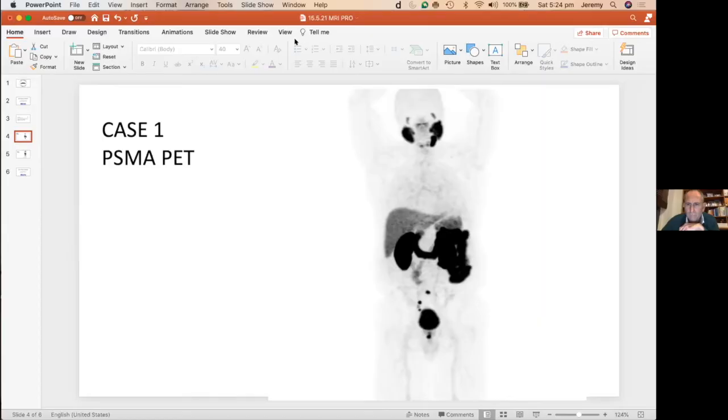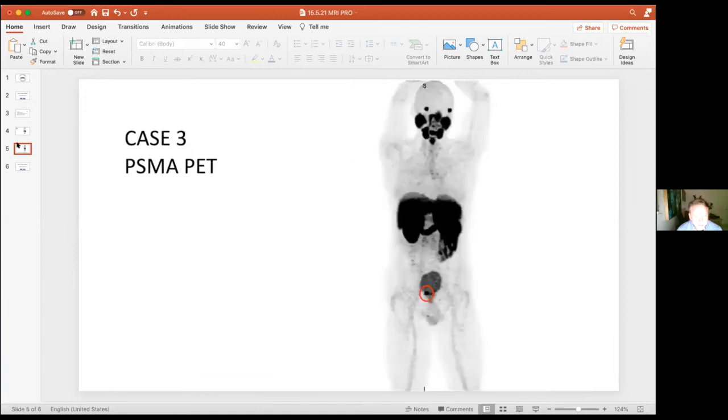So I'll just quickly show you what that PSMA PET looked like. While you're getting that up, Jeremy, I've seen noted multiple questions about how you do your transperineal biopsies and whether it's general anaesthetic, local anaesthetic, especially if you're peppering target areas with large numbers of cores.